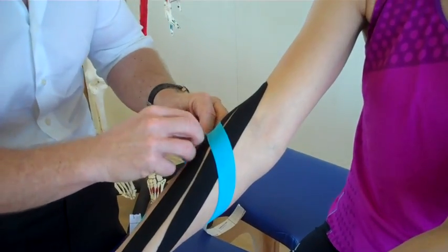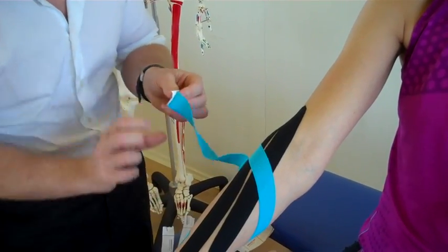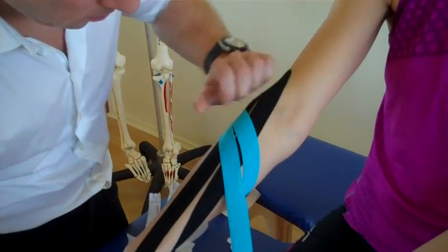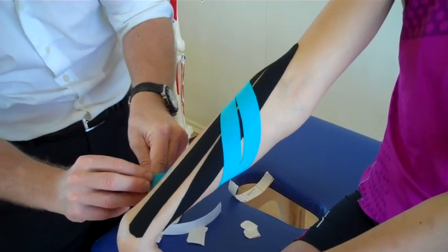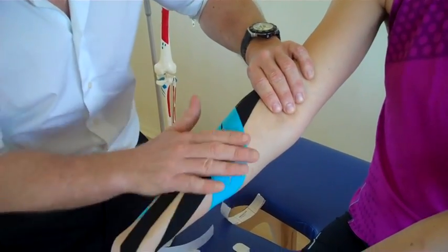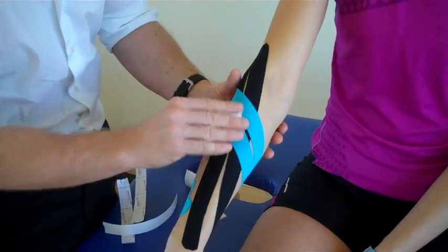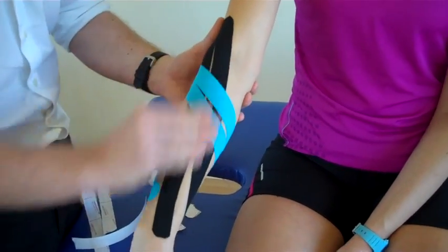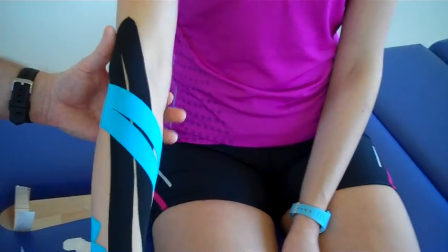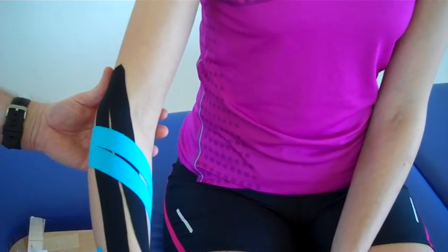And the same on the second piece of tape — bring it back, remember there's no stretch on the end of the tape, 80% stretch, feed that around, and then no stretch at the end. You can either use your hands to warm up the adhesion on the tape, or you can use the back of the tape to warm it up. And there you have kinesiology taping for lateral epicondylitis. Thank you.